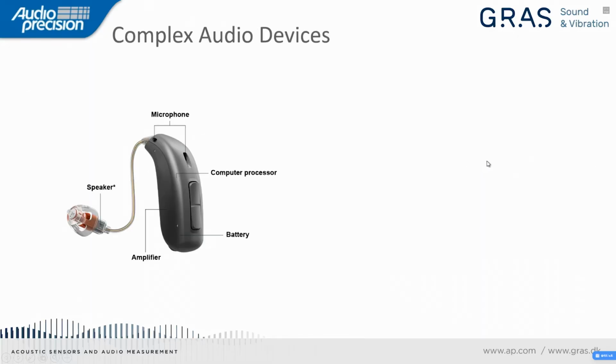All right, so a little bit about hearing aids. These are very complex audio devices, and they're quite interesting from an audio test point of view. They're one of the few audio devices that are both acoustic in and acoustic out, which makes them quite unique. They're tiny little devices that are battery powered. They fit in a small package, typically behind someone's outer ear, or they can even be hidden right inside the ear. They have a couple of microphones typically. They have a power amplifier, a loudspeaker, and a digital signal processor built in, and then some controls. Those are the basic elements of a hearing aid.